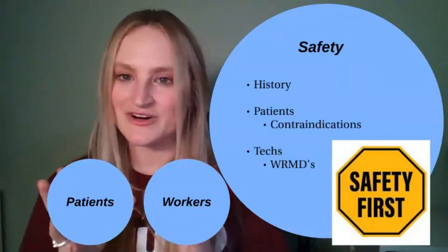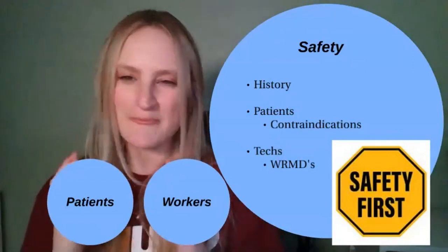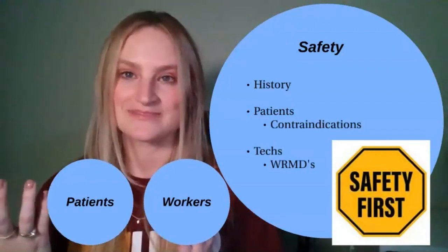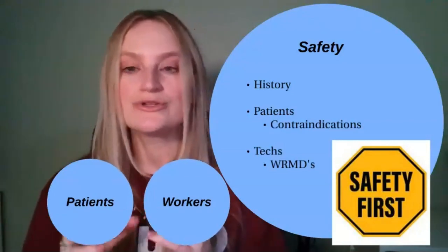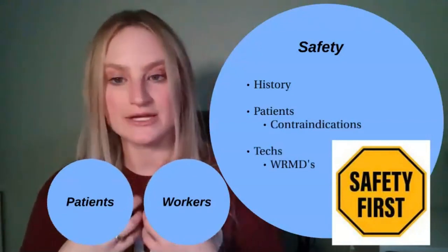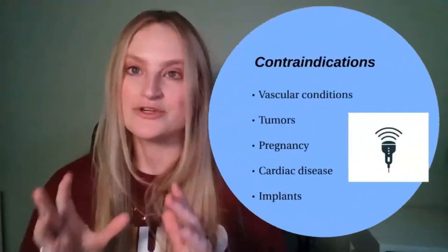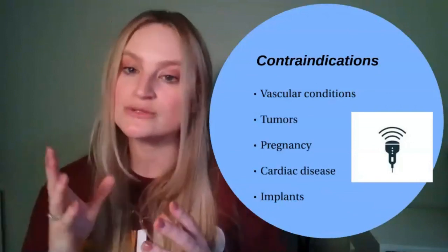Therapeutic applications of ultrasound actually predate its use in imaging, and it was used for many years before it was considered an imaging modality. It is typically considered to be a very safe treatment tool due to its minimally invasive nature. That being said, there are a few major safety concerns we should be aware of, and contraindications do exist.